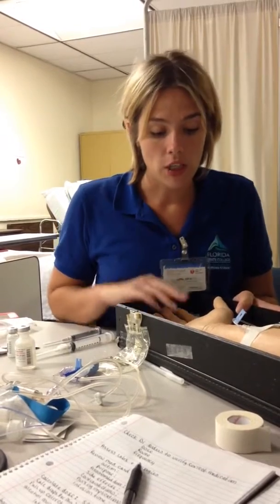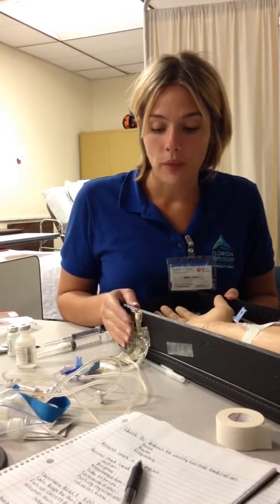And I have verified labs and the CBC, the BUN and creatinine, and in the CBC, the WBC, white blood count. So this patient needs this medication, and so I am going to be administering that via a mini bag through an IV that's already been established today.